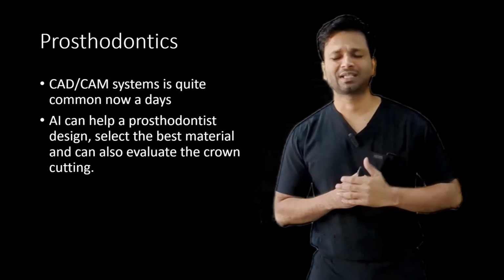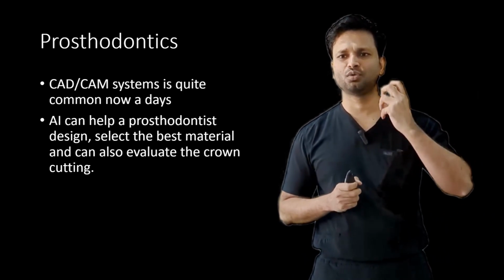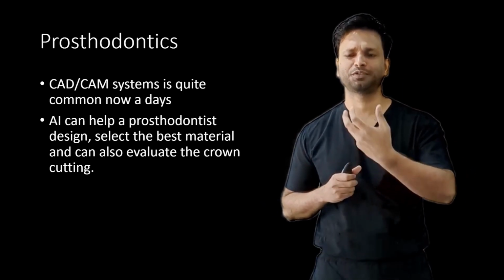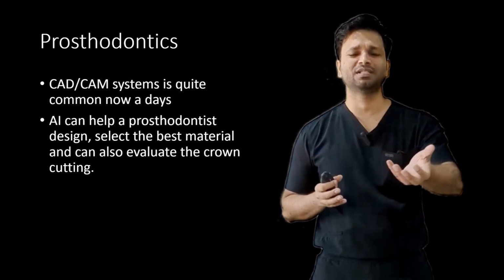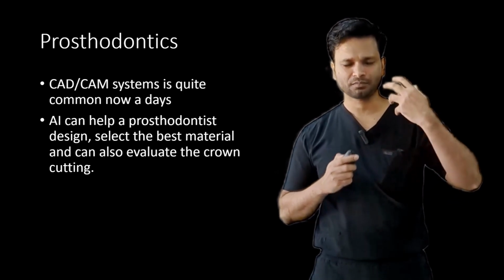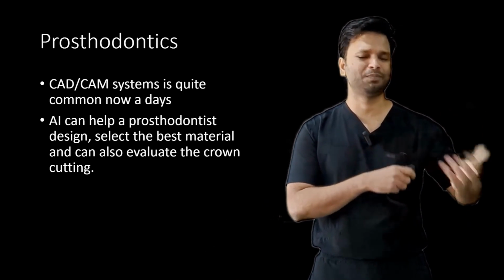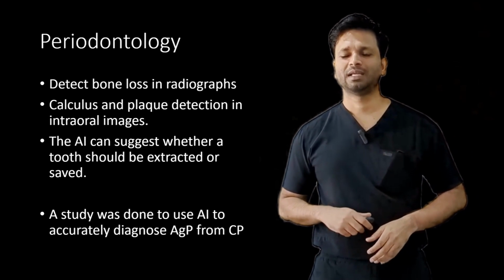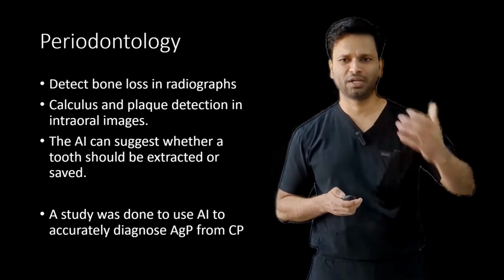Now coming to prosthodontics, CAD/CAM systems in prosthodontics are quite common nowadays. So AI can help prosthodontists select which material is going to be best for the specific case. And if you want, you can feed the intraoral images using the intraoral camera to the AI, and it can evaluate the crown cutting for you. This can be used in institutes to teach your students, be it PG students or UG students, proper crown cutting.